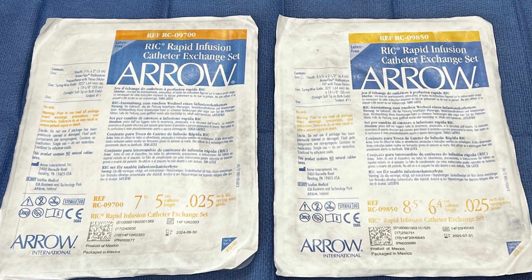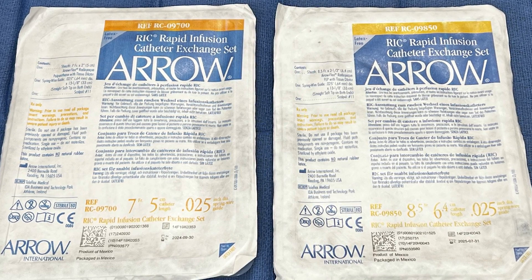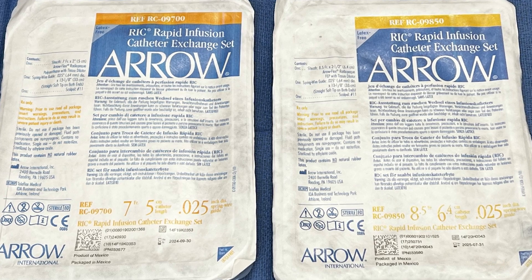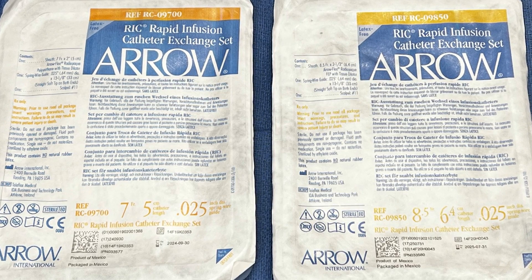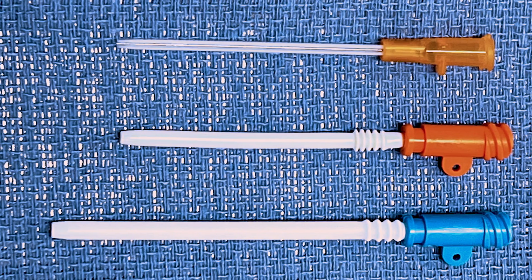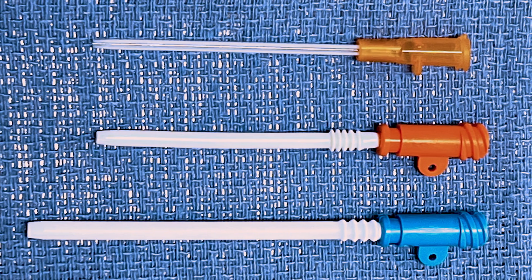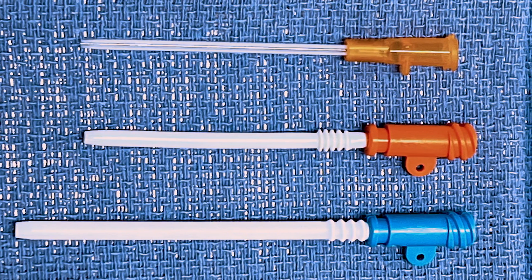The Arrow product line offers two catheter sizes: a 7 French and 8.5 French catheter. Since both catheters can handle a Belmont rapid infusion device at full flow, the 7 French catheter is appropriate for most situations. RIC lines are the largest peripheral IV catheters available on the market. Here, you can see that RIC lines dwarf even a massive 14-gauge IV catheter.